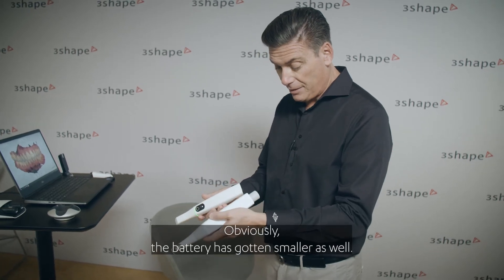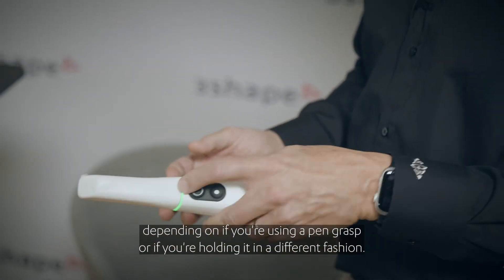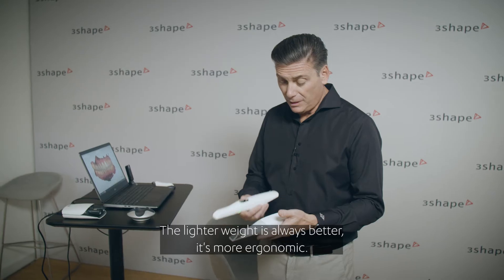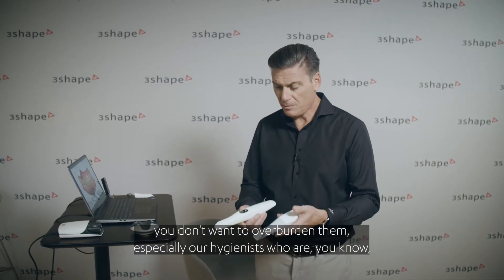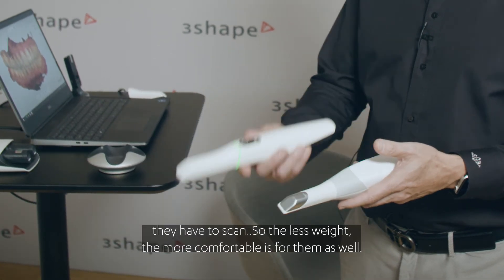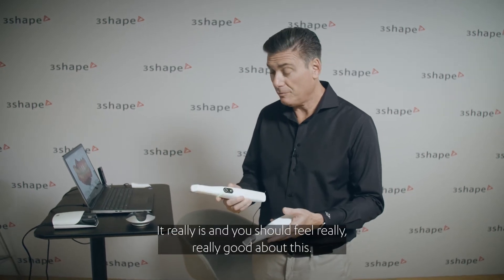The battery has gotten smaller as well — it's not protruding out the back end, so it's less obstructive to your hand whether you're using a pen grasp or holding it differently. Lighter weight is always better, it's more ergonomic, and for your team members as well — you don't want to overburden hygienists who have to scan, so the less weight the more comfortable it is for them. It's a beautiful looking unit.